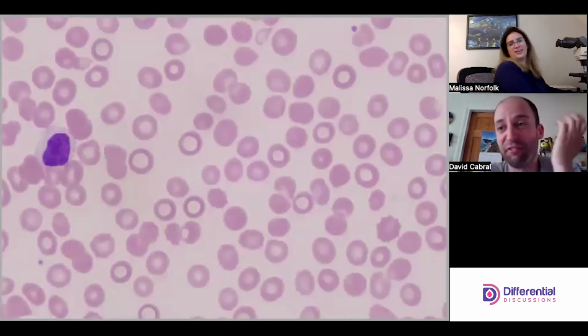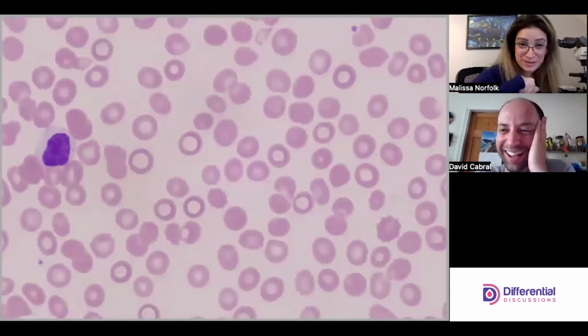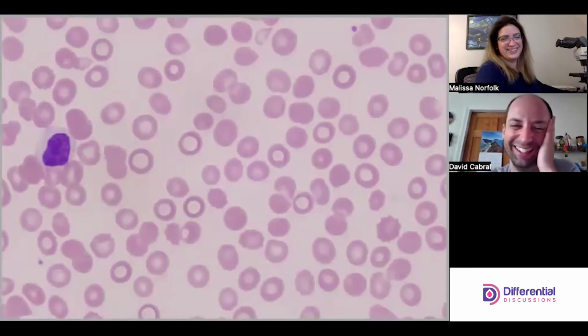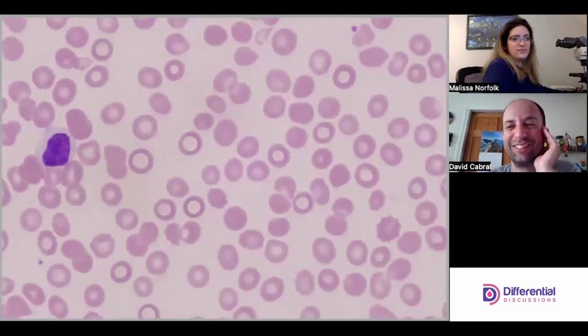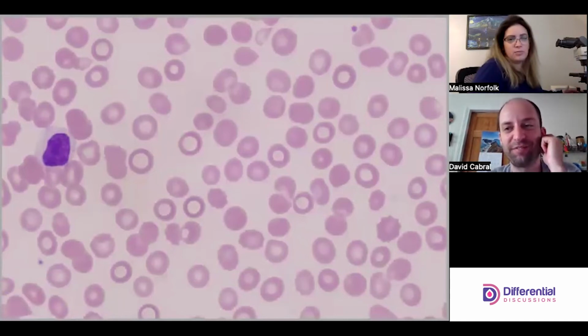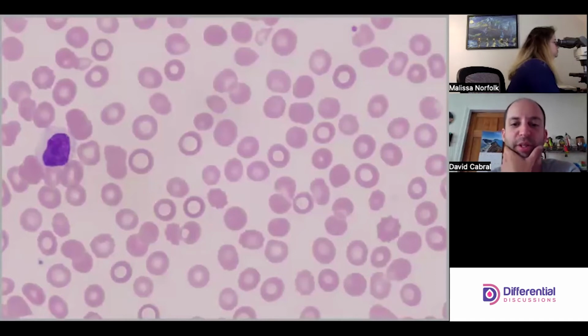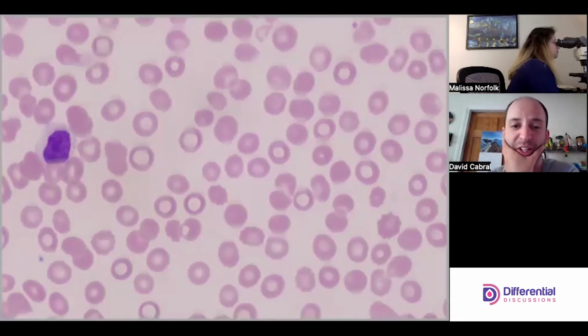Cool. A lymph. Something we can look at and say, I know what you want. It's a lymph. This one's got a little bit more cytoplasm, but he's still got the characteristic lymphy cytoplasm with the lymph chromatin clumping. Yep. Pretty guy. Pretty cell. It's good to see a normal cell every now and then.